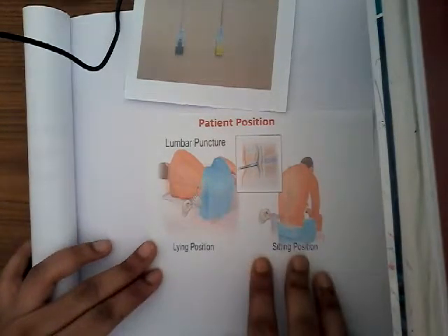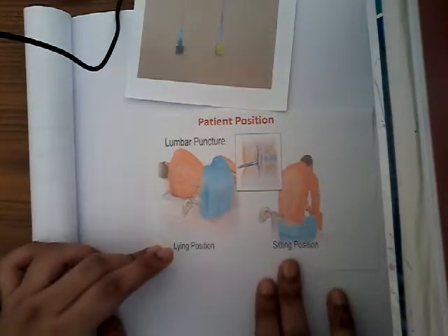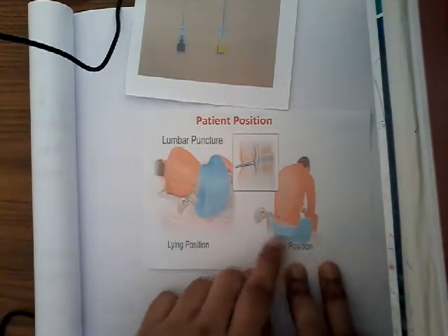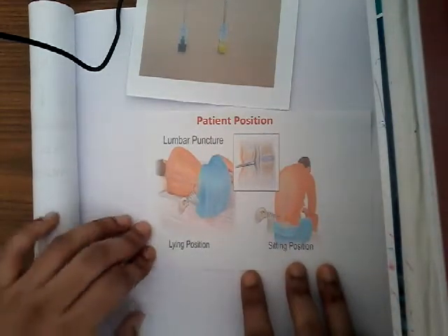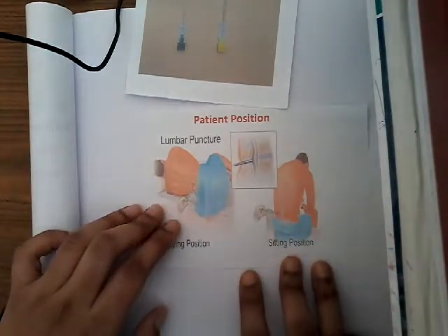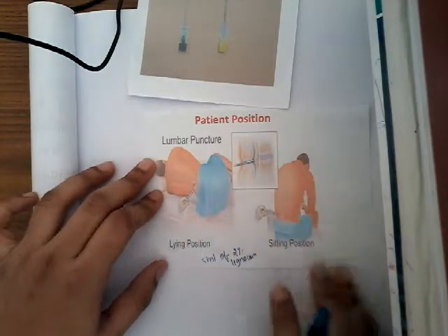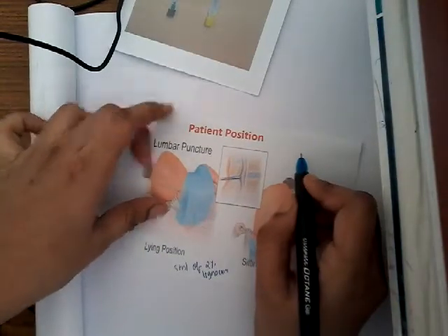Always check whether there are any deformities of the spine before attempting the procedure. Whenever you find deformities such as lumbar spondylosis, you should adopt the sitting position instead. First, we swap the area and then give local anesthetic — mostly five milliliters of two percent lignocaine.